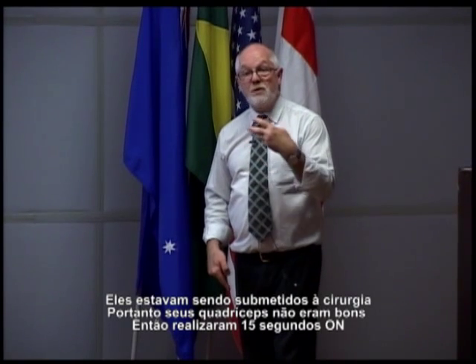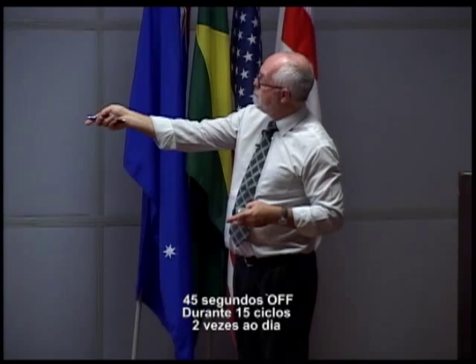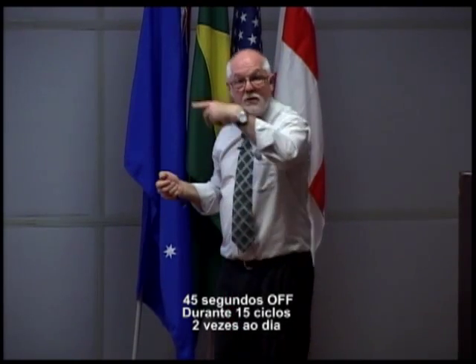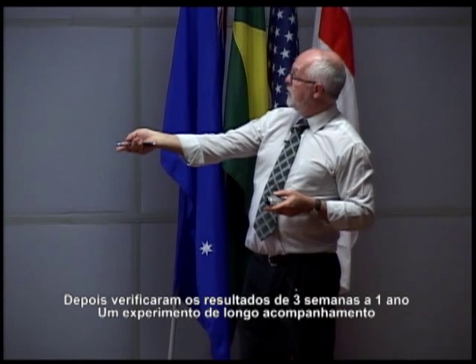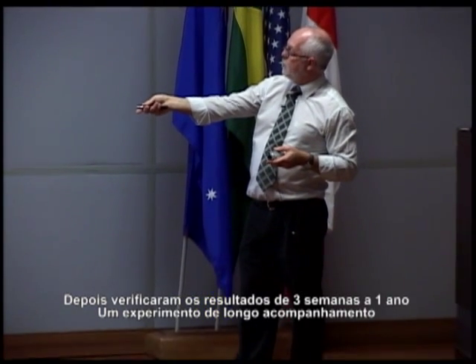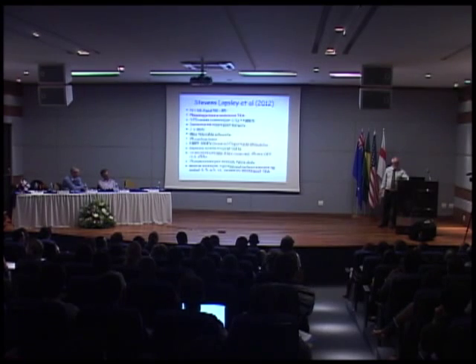So their quadriceps were not good. So they were doing 15 seconds on, 45 seconds off, and they're doing that 15 cycles, and they're doing that twice a day. And they were then checking their outcome measures at 3 weeks, right up to 1 year. So it's a long follow-up experiment.